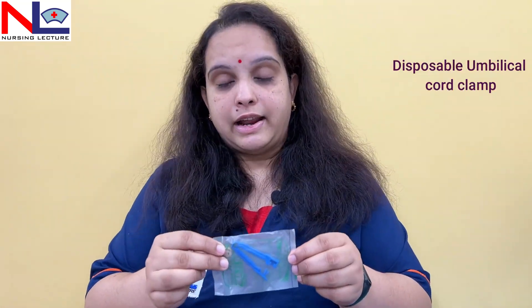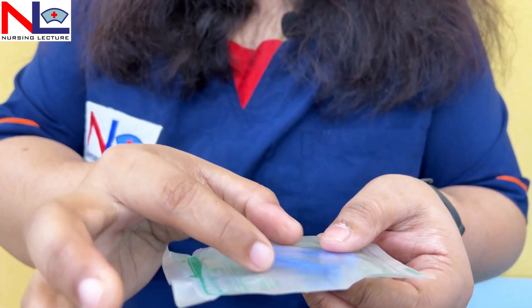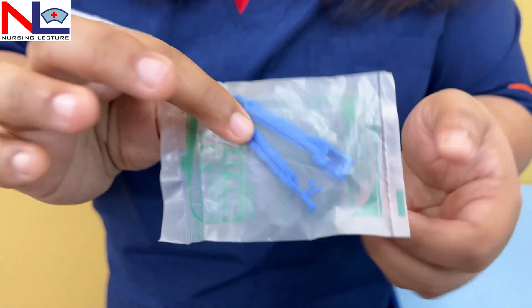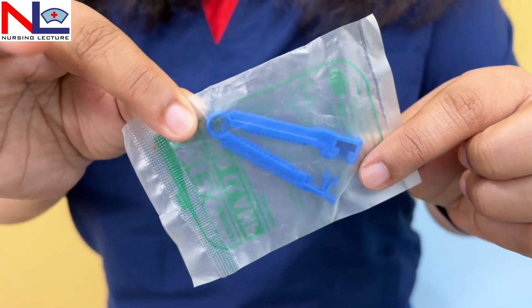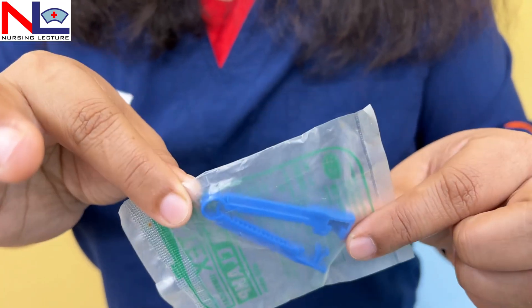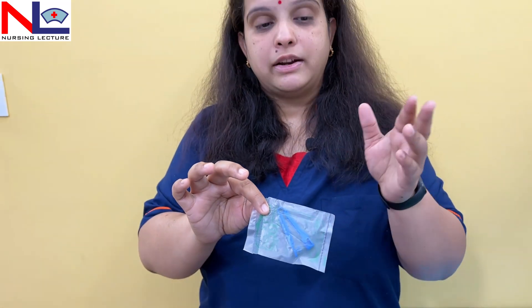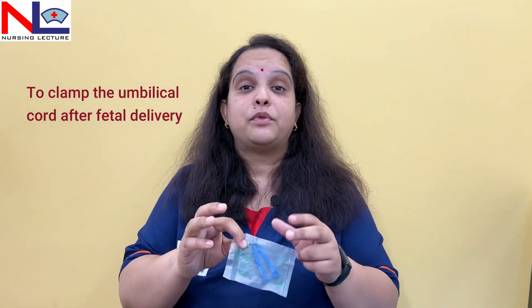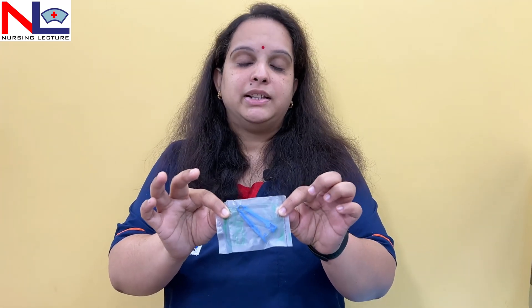The last instrument is the disposable umbilical cord clamp. It is made of plastic and is used to clamp the cord three to four centimeters from the fetal umbilicus. Once the fetus is delivered and separated from the placenta, the open end of the cord on the fetal side needs to be clamped with this disposable clamp.